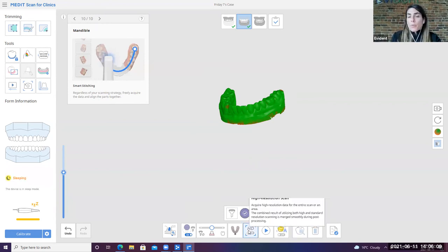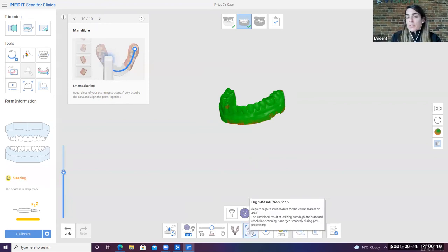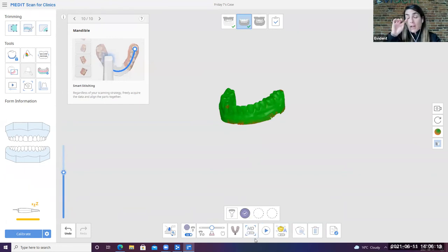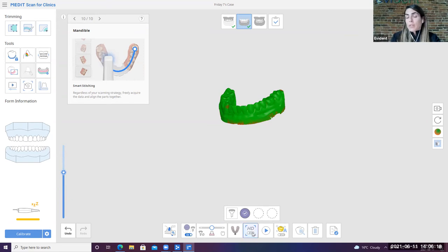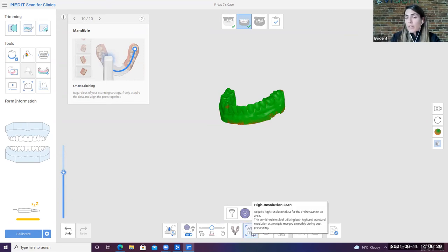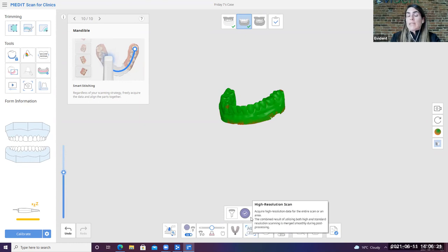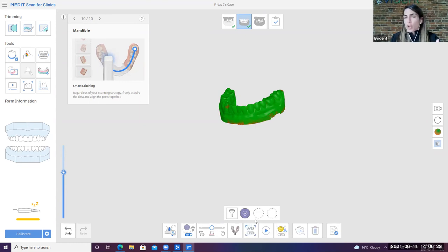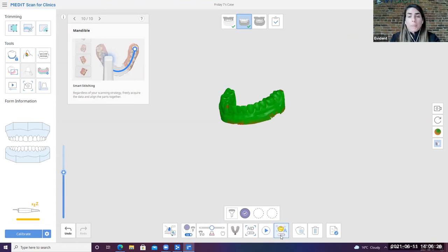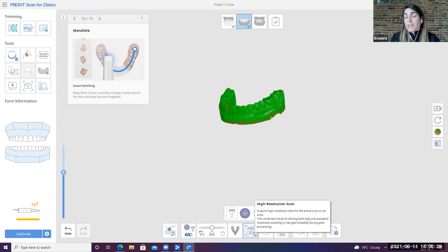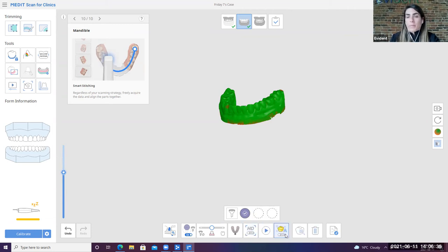The other notable button here to consider is the high resolution scan. This can be something that's very helpful with your crown and bridge type cases. If you're scanning for prep or anything, it's always great to toggle the HD on as well as any implant cases and larger, more complex tissue type cases. I wouldn't recommend scanning all of your cases in HD because it does eat up a lot of your memory. But we do work through the product based training as to when to use it and why not to use it.